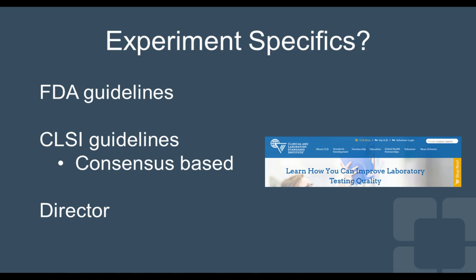So for experiment specifics, there's not much listed in the CLIA law. However, you can look at FDA guidelines for IVDs, CLSI guidelines. These are consensus-based guidelines on different areas in the laboratory. And then the medical director or director of the laboratory who's over the test.